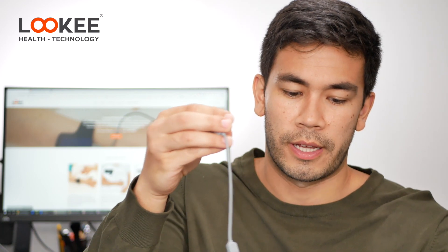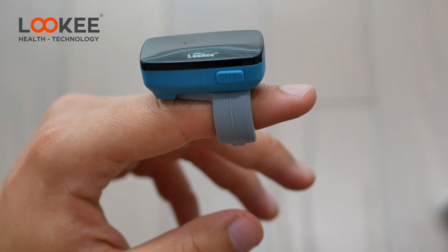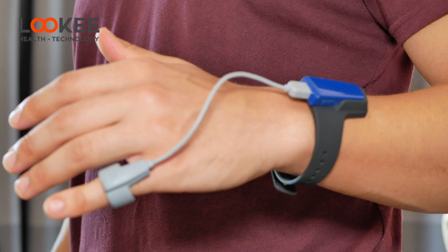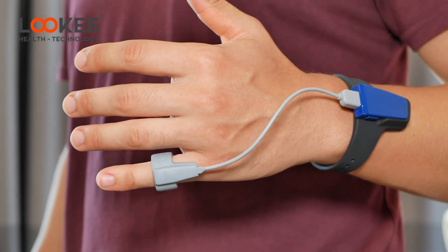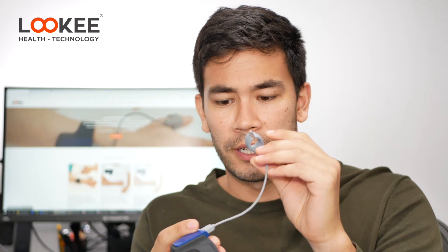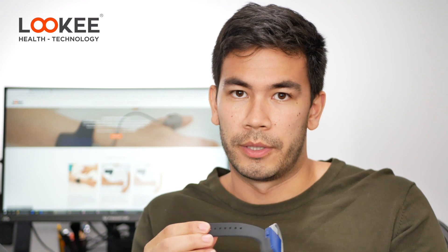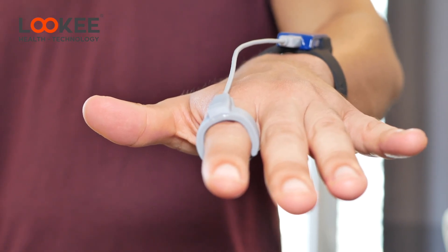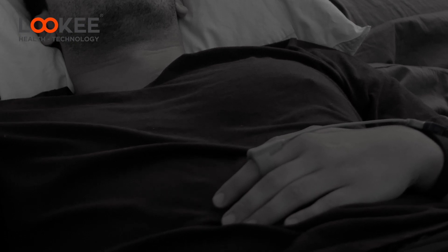This is the wrist strap version; there's also a ring version — it really depends on your preference. I find both very comfortable. The wrist strap distributes weight well, and when it's on your finger it's very light. The rubber is very comfortable, so I barely notice it at all when I'm falling asleep.